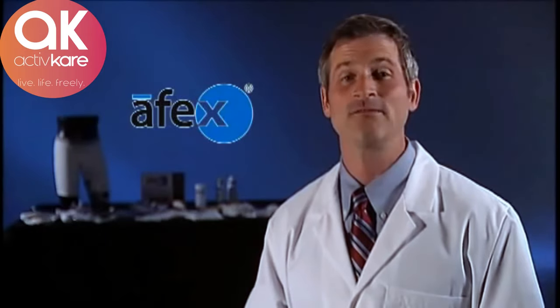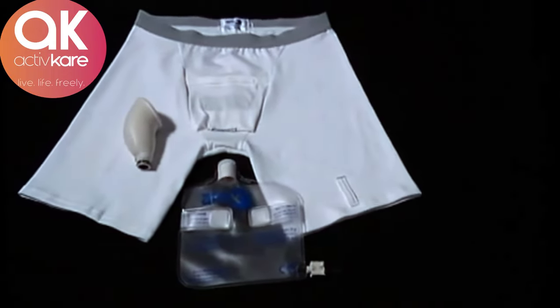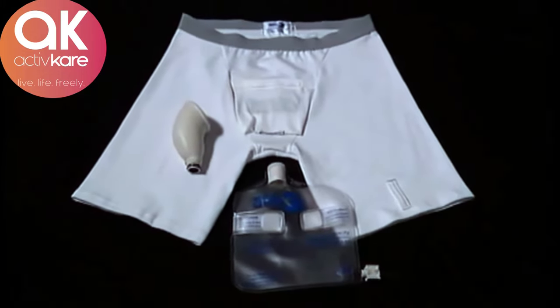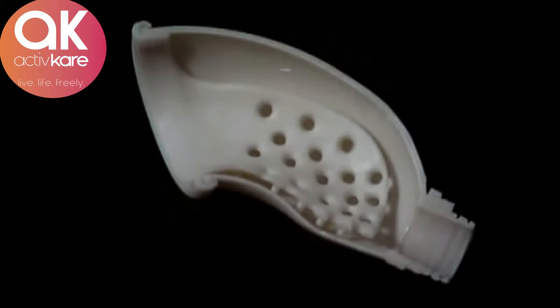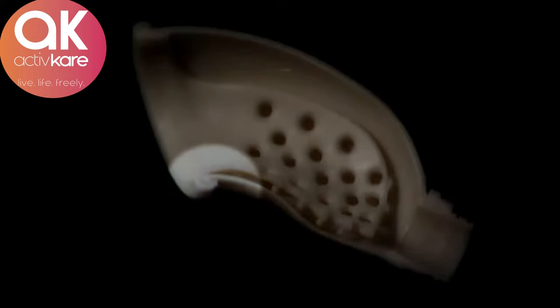Here are some details on how the innovative Afex system works for men. The Afex system is composed of three components consisting of a patented receptacle, a pair of boxer briefs, and a collection bag. The receptacle is composed of a firm but flexible outer shell and soft inner liner. The inner liner creates a unique double wall so the skin is elevated away from the residual urine and wetness.